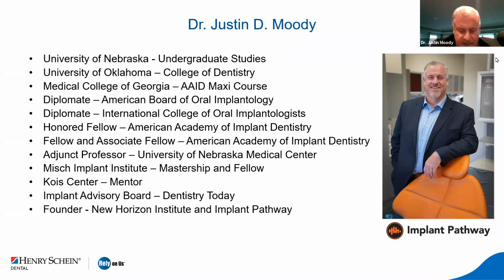I'm going to talk about technology, and I think that all technology is useful provided it can come back to your practice and either make it safer for the patient, or make it more efficient, profitable, successful, predictable, all those things in your private practice. So one of the things that I've found that does all those things is the use of a surgical guide in the placement of dental implants.